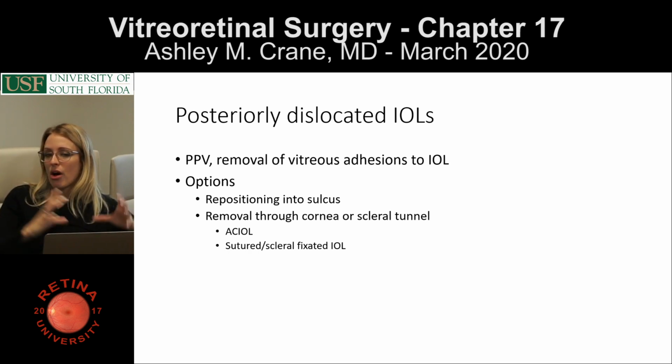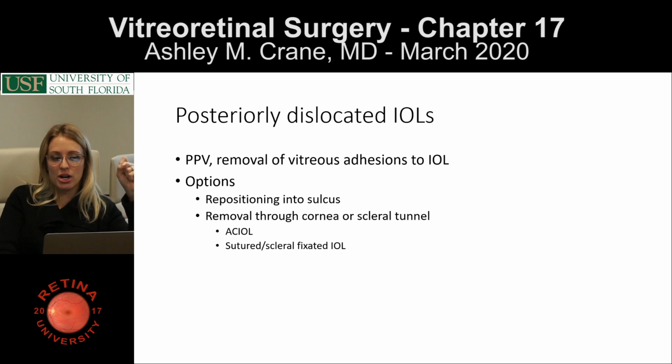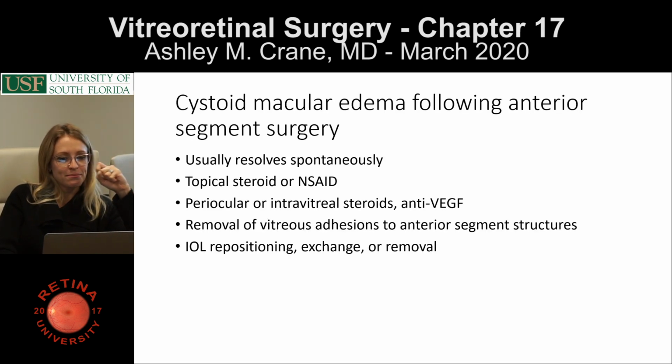That's possible, although oftentimes the anterior capsule phimoses, and so when you try to bring it through, it messes up the anterior capsule and you can't get it in. An AC IOL or a sutured or scleral fixated IOL, those are options.